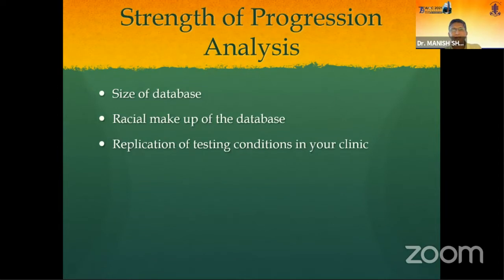This is the glaucoma progression analysis system, and it is similar in all the more advanced perimeters. The strength of the perimeter lies in the size of the database. Basically, the testing hardware itself is not such an expensive or fancy thing, but it is how you put it through the tests, calibrate it, and put the data into the machine so that the analysis comes out more useful.